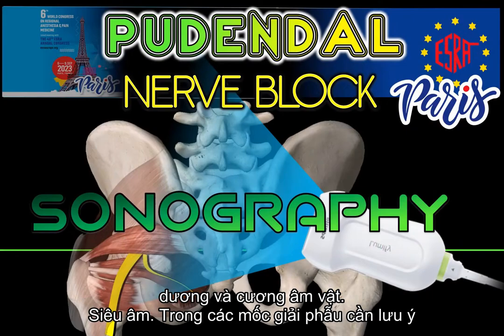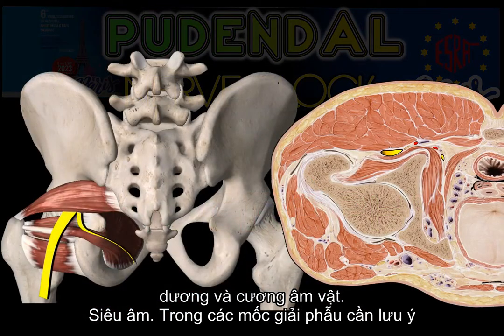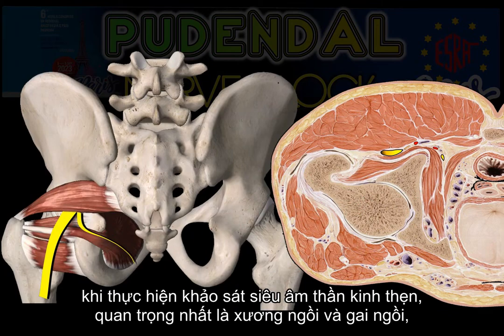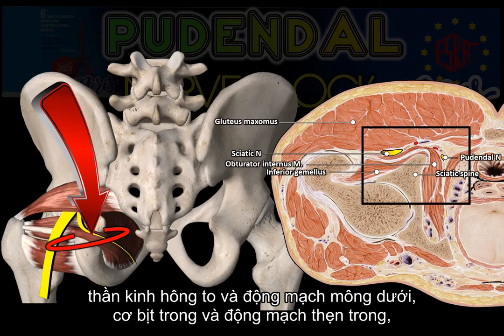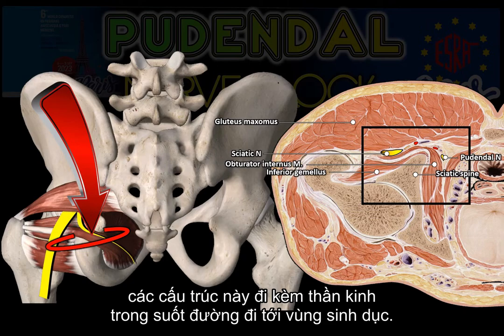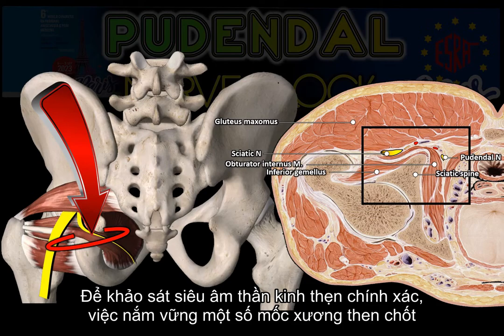Sonography. Among the anatomical references that we should remember when carrying out the ultrasound examination of the pudendal nerve, the most relevant are the ischium and sciatic spine, the sciatic nerve and the inferior gluteal artery. The internal obturator muscle and the pudendal artery accompany the nerve throughout its course to the genital area.